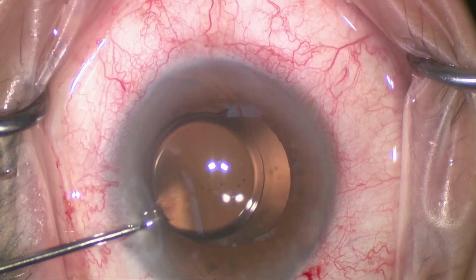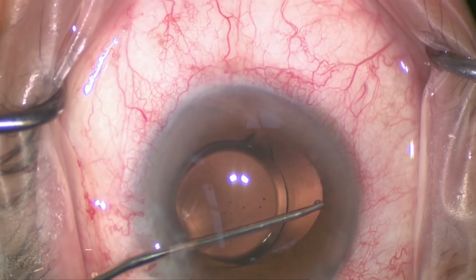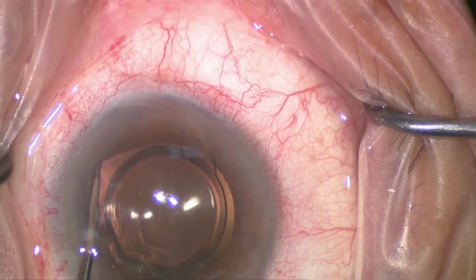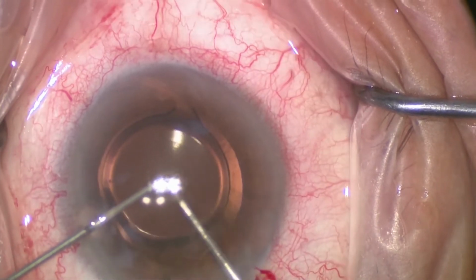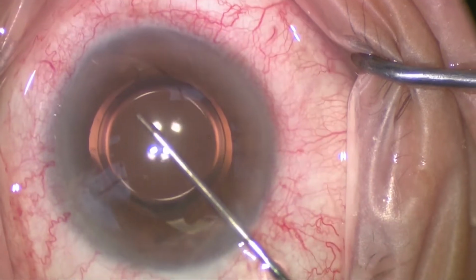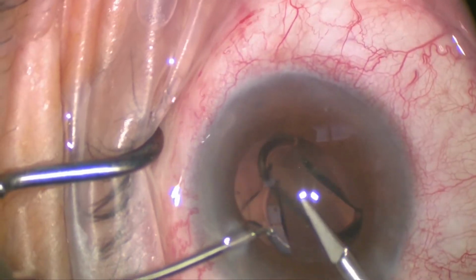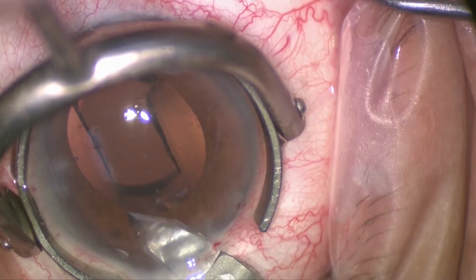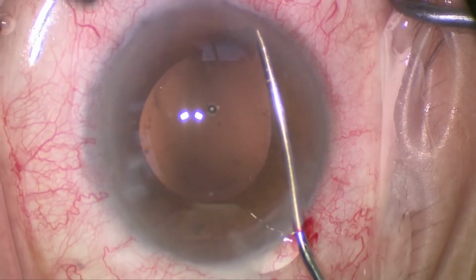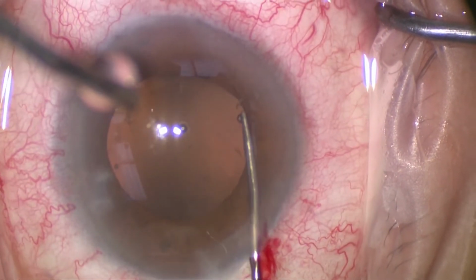The bag is again inspected, and there is no sign of any scar, remnant lens epithelial tissue, or fibrotic changes. In fact, even at 8 years post-surgery, the capsular bag looks more clear than we would typically see even a day or two after surgery. The lens is rotated and removed in 3 pieces using MST microscissors in an atraumatic fashion. Here you can see an excellent red reflex through the clear acellular bag. Of note, the surgeon who had done the initial surgery was very skilled and not known to polish the capsule excessively either.